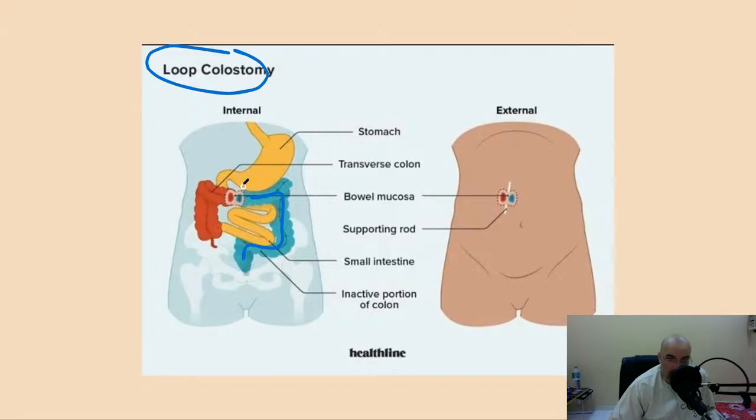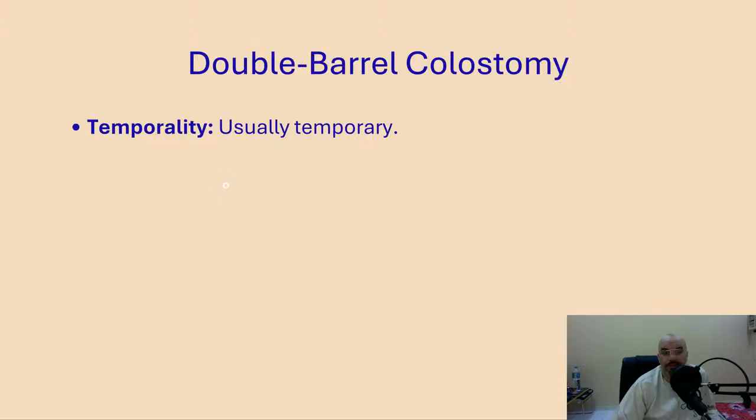Here, I hope you can also notice that there is no complete separation. So that's why the closing of the stoma later will be much more proper for the patient.